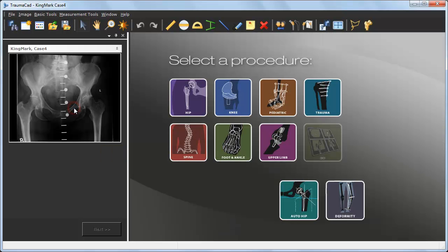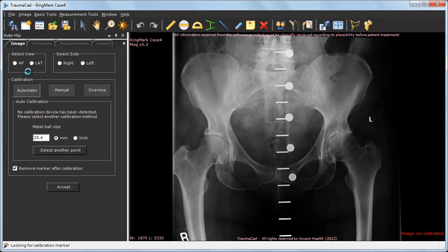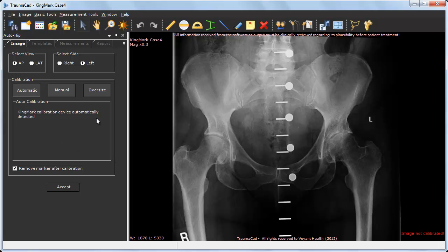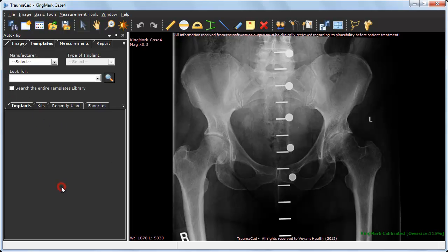Select the surgical procedure — auto-hip in this case — and move on to process the image and calibrate it. Using a single or double calibration device is necessary for accurate measurement results and implant sizes. Here we have Kingmark, a double calibration device which is automatically detected by the application. Just click Accept and the image is processed.